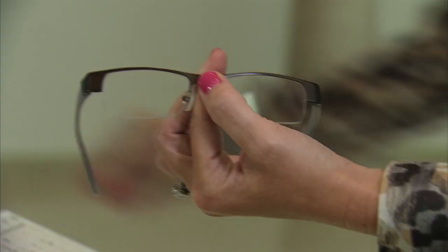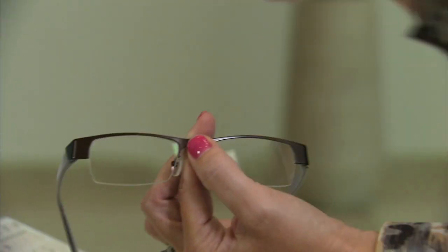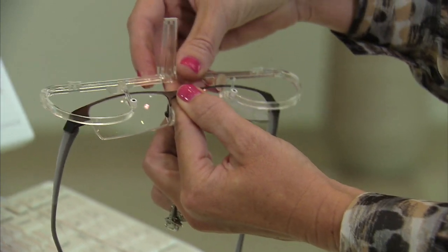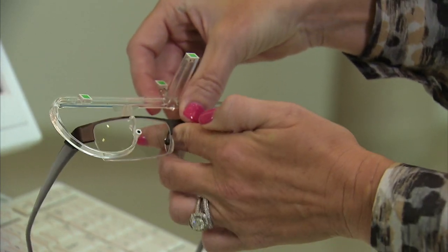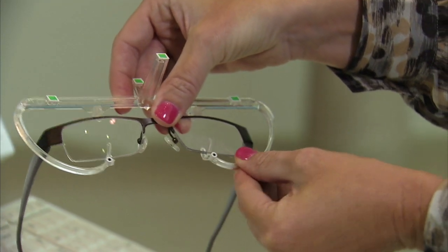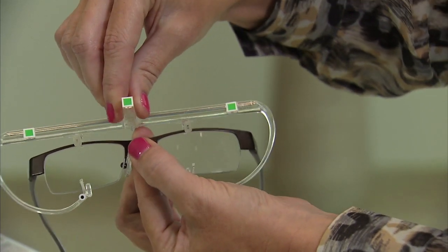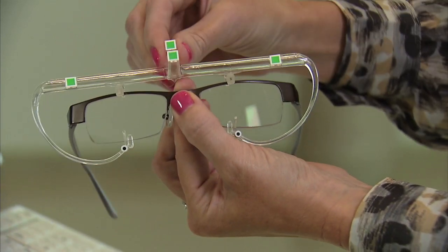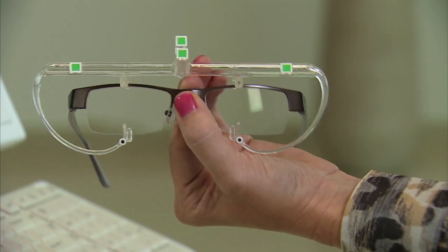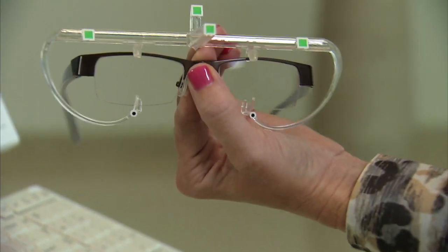To place the clip onto the frame, hold the clip in one hand while guiding the top edge of the frame into the rubber feet along the top edge of the frame clip. With the opposite hand, pull down the bottom frame clip arms until they are locked onto the bottom edges of the frame. Before handing the frame to the patient, ensure that the clip is centered and that the center tracking arm is facing directly outward. This will return the most accurate measurement possible.